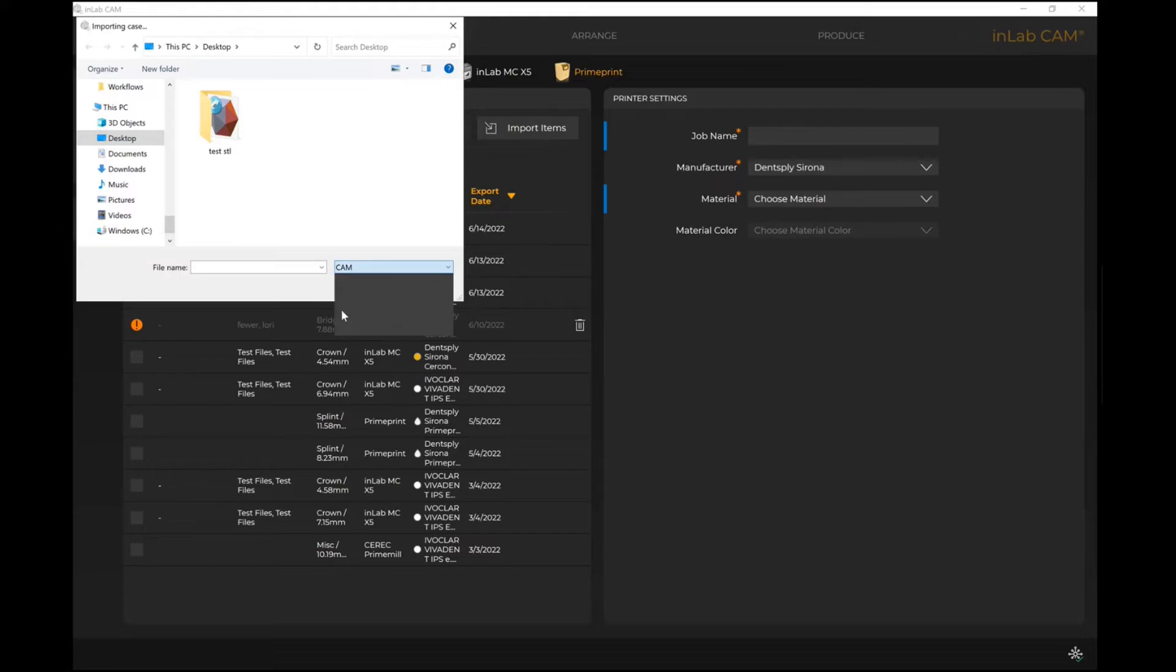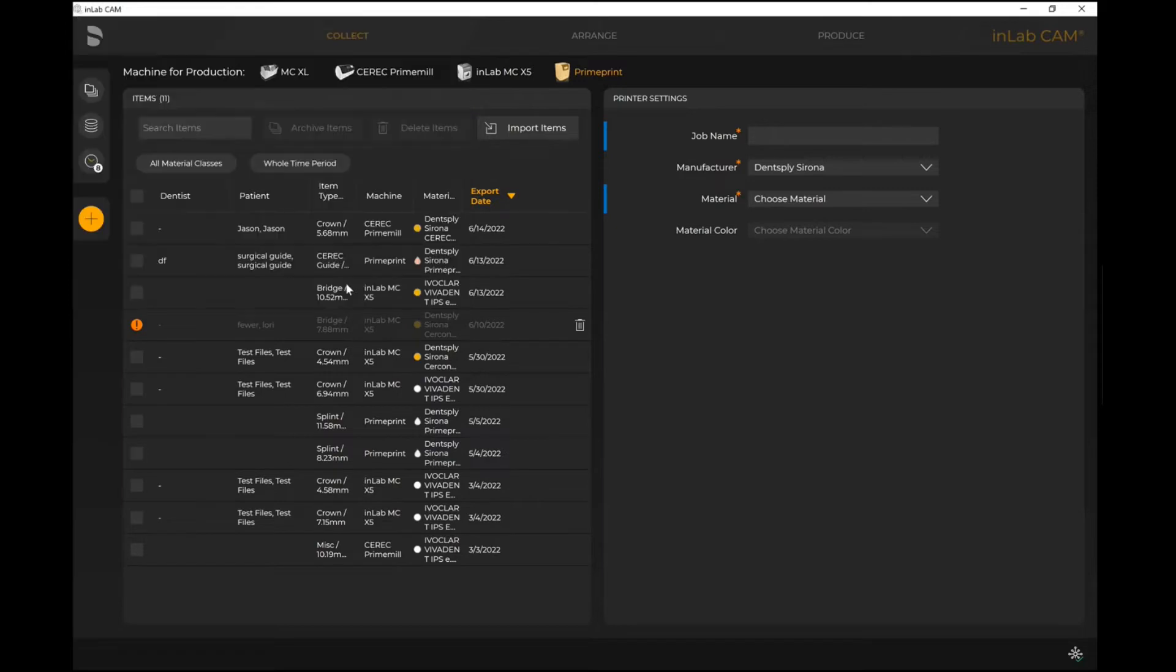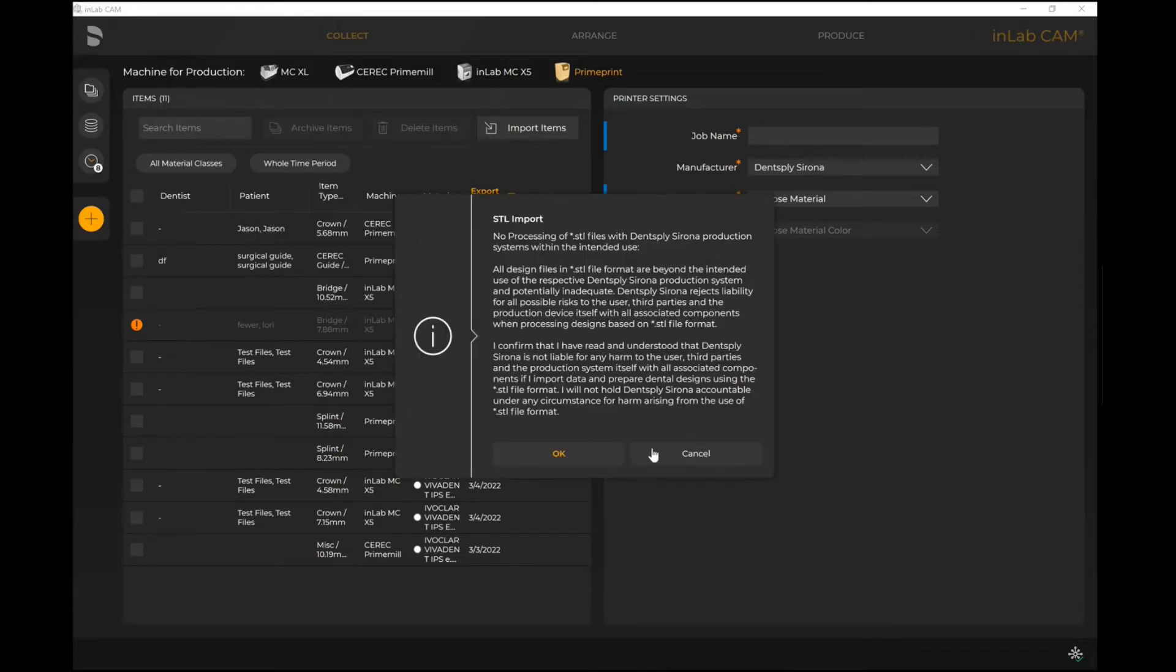You'll see STL files are available, Exocad construction files are available, and as well as 3Shape design files are available. So if I go ahead and select STL, when I come in to find my STL in question, I can select Open here and bring this in.